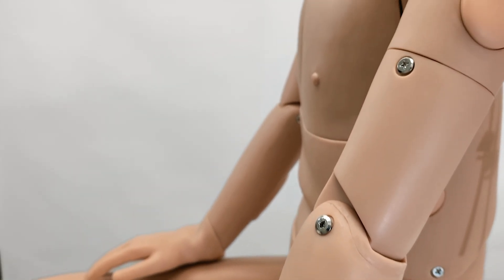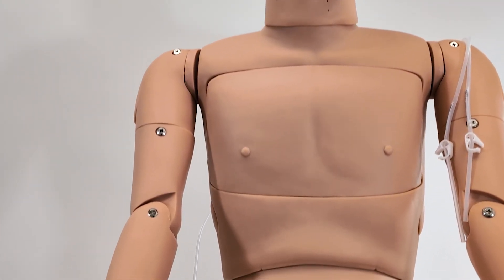Experience excellence in nursing education with the Anatomy Lab Dual Sex Nursing Mannequin, available exclusively from Anatomy Warehouse.